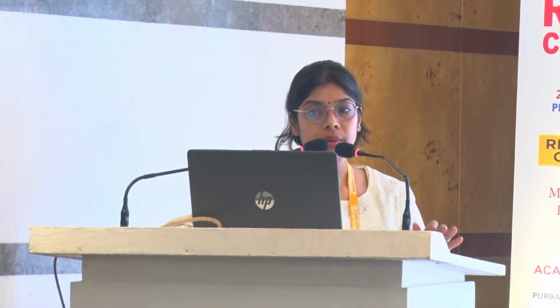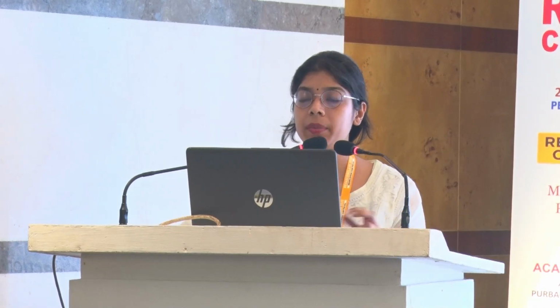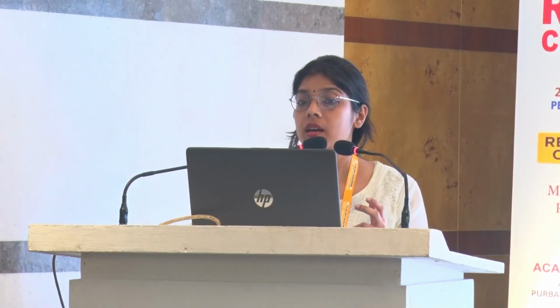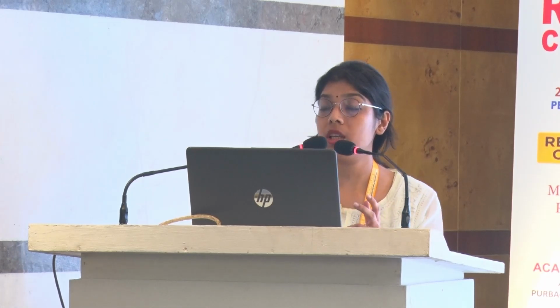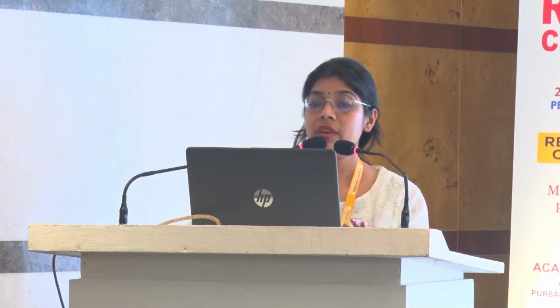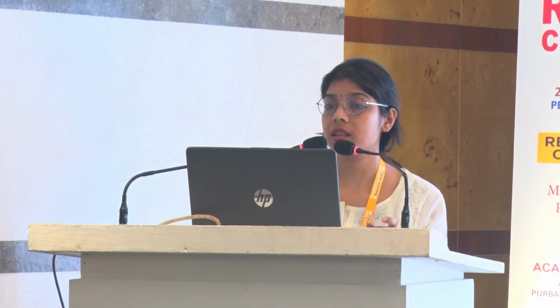So how do we use ultrasound in rheumatology? It is to diagnose articular and periarticular inflammation. We can check for subclinical and early arthritis in patients who come with polyarthralgia, where we are not clinically able to diagnose whether they have evident arthritis or not.